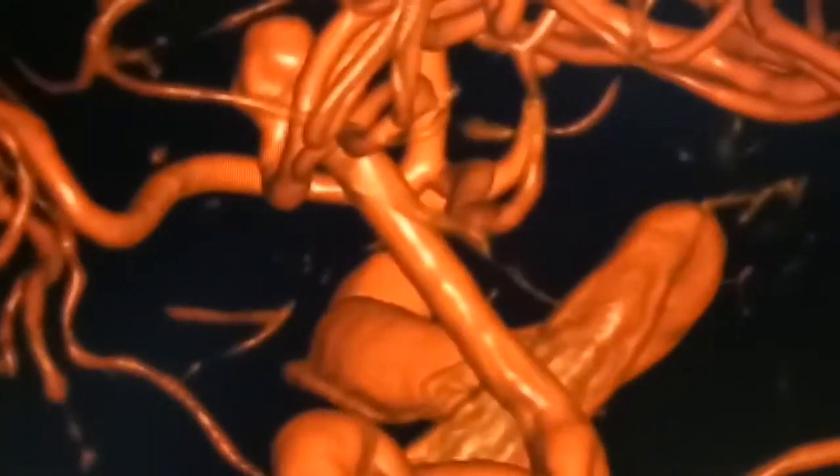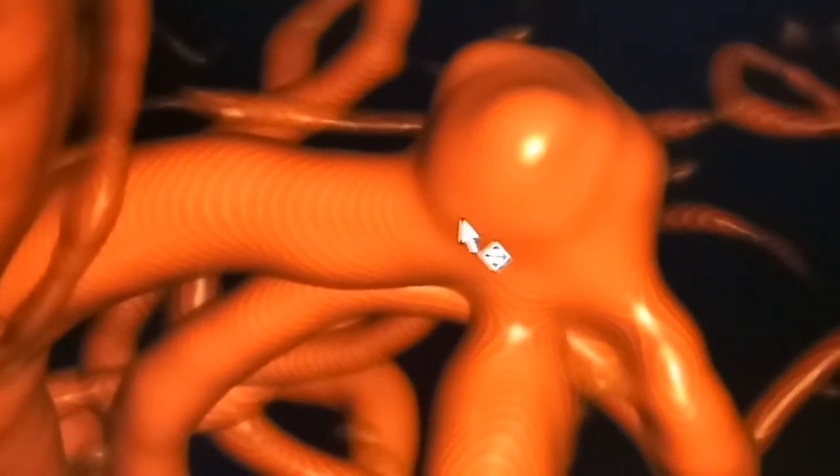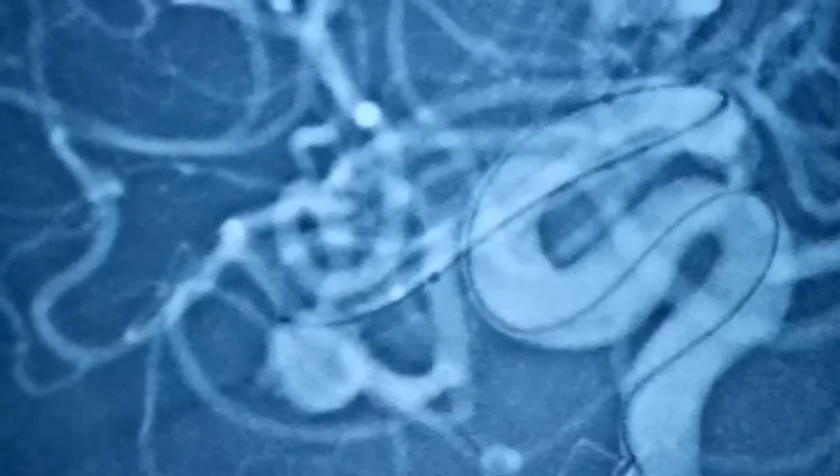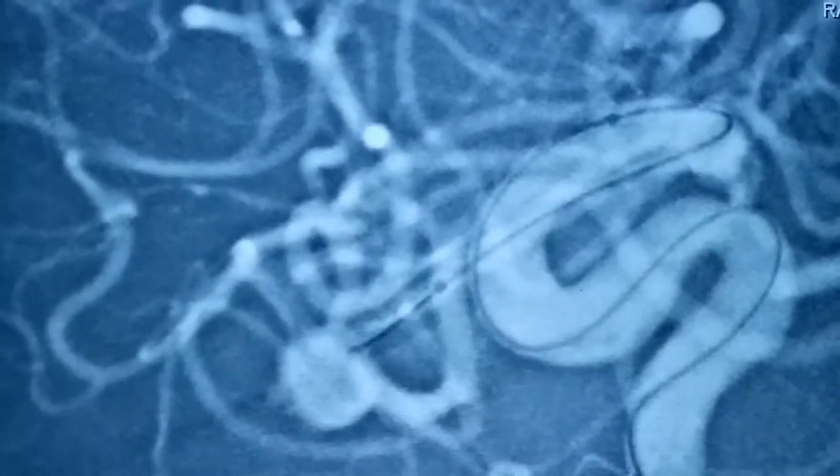Our idea will be to reconstruct this aneurysm. We will go from the M1 side of the artery and put a stent across this dominant branch, try to protect that branch through the same stent, then go across into the stent and enter the aneurysm to coil it. This is the plan to handle the vessel going all the way from M1 into the aneurysm.